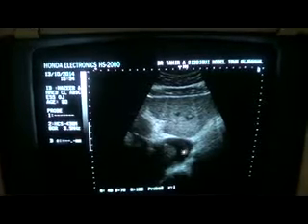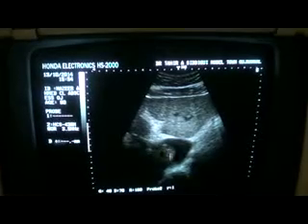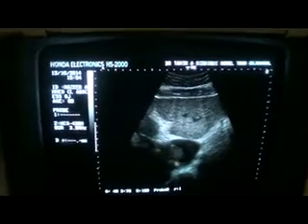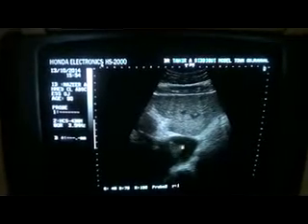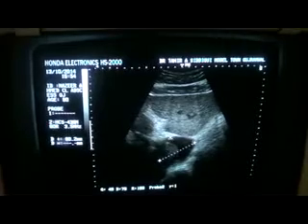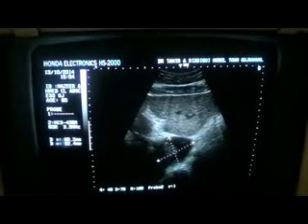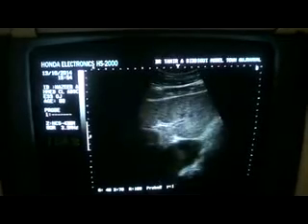This is the fluid part, and these are the echoes that are seen within the cystic mass relating to the segment 1 or caudate lobe of the liver. Now this is pathology number 1.